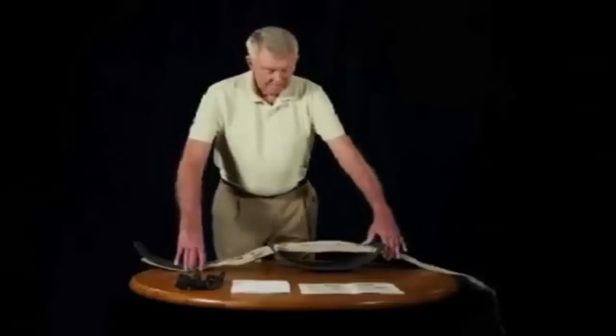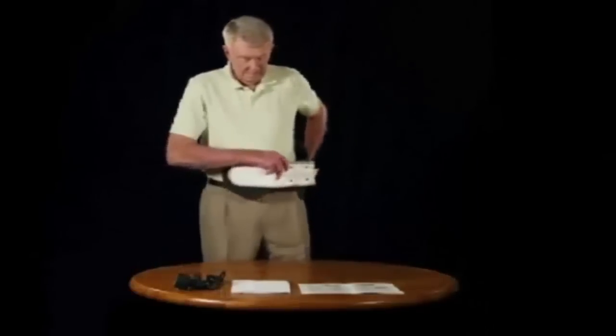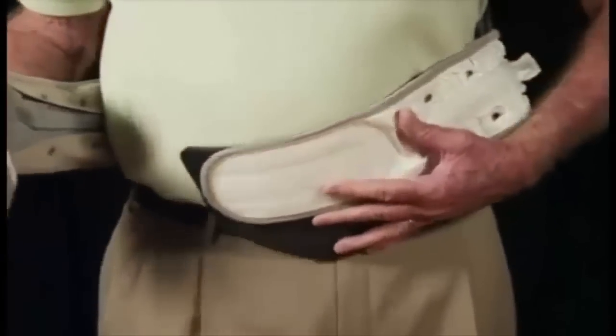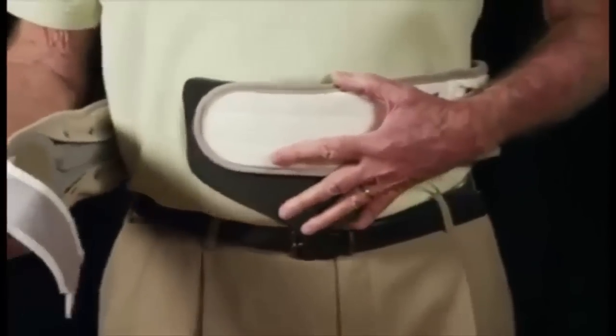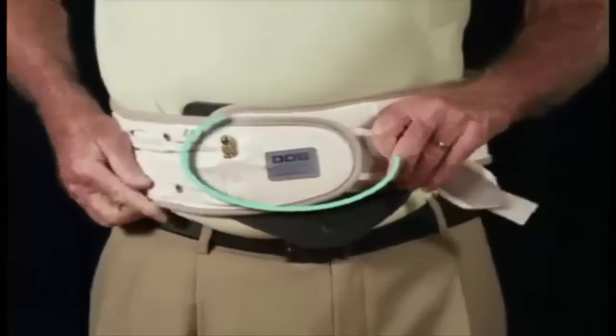Step 2. Place the Back Traction Belt around your waist and make sure the DDS logo is in the center and upright position. The DDS Back Traction Belt can be worn on bare skin or over a light t-shirt. Then attach the main Velcro closure.